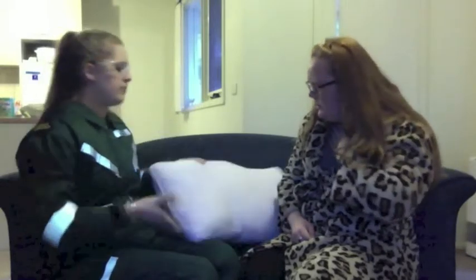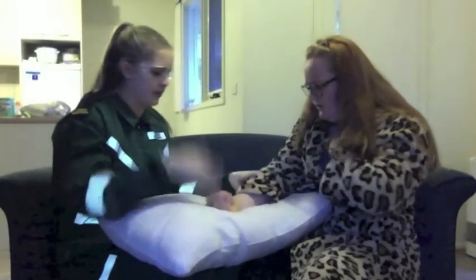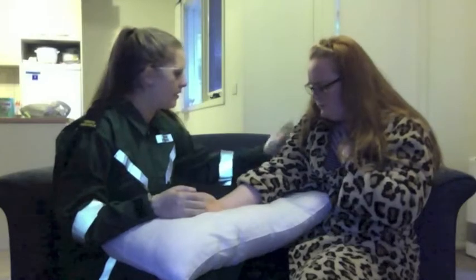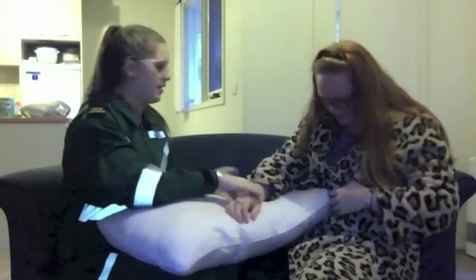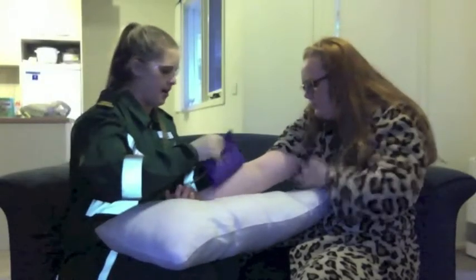Good, so Mrs. Jones, we're just now going to take your blood pressure, okay? Have you had your blood pressure taken before? Yeah. Good. Do you remember what your blood pressure was? No. That's right. Yep, so just have your arm that way. Good, and nice and relaxed. Are we just able to take your arm out of this dressing gown? Is that okay? Or are we able to pull it up? No worries. So I'm just going to pop this cuff around your arm.